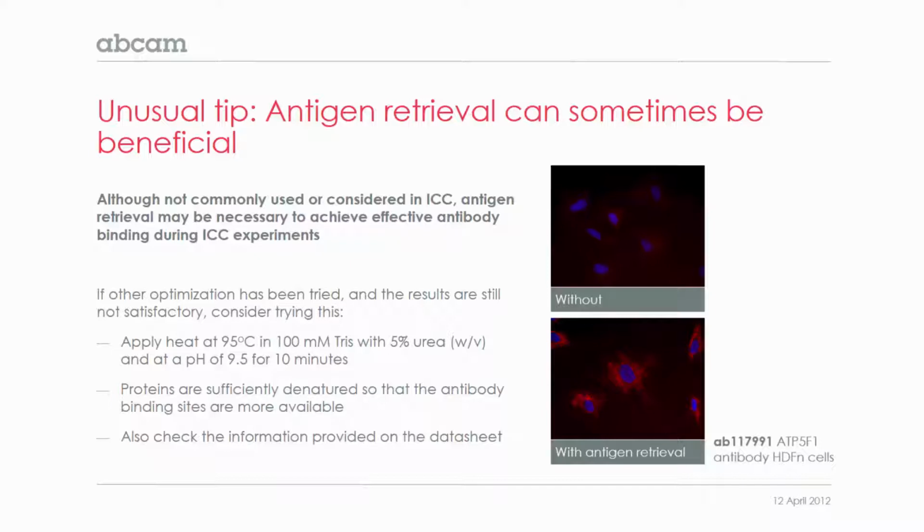However, from some data we have, we know that it can sometimes be necessary to get the optimal results. So we would say that if other optimizations have been tried and the results still aren't satisfactory, particularly if you're not getting any staining, then you can consider including this step.